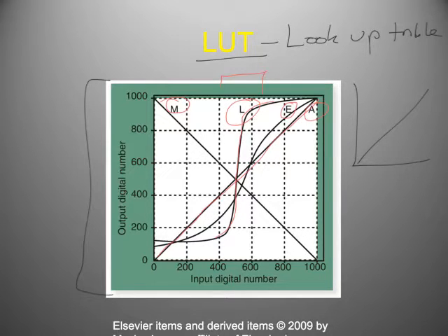The way that some other writers have argued is that there could be, across the board, a 15% increase in KVP. Now, he's just said that there could be lower techniques than film screen. But the way that we're talking about that now is a 15% increase across the board in KVP. How is that a lower technique? There you go. That's it exactly.